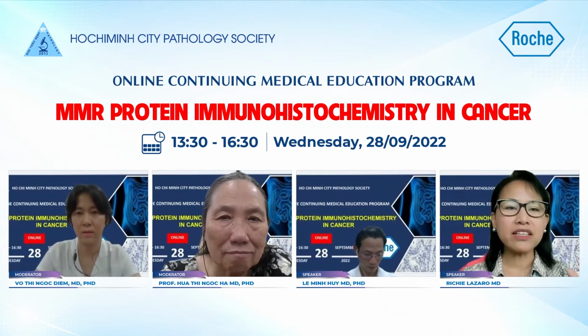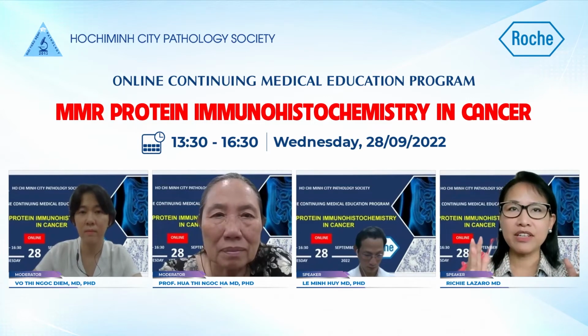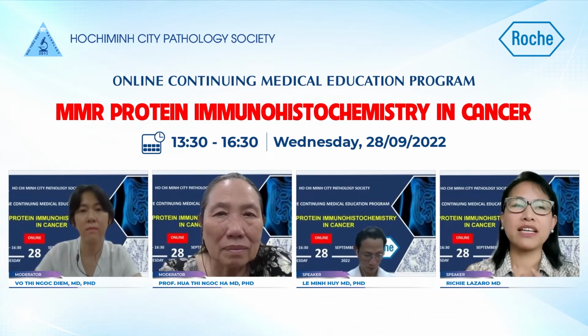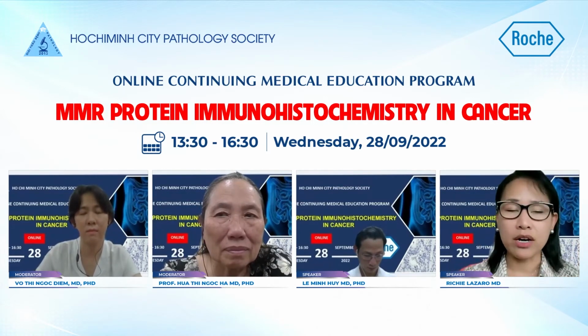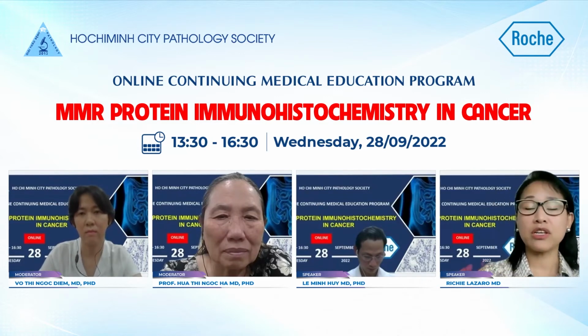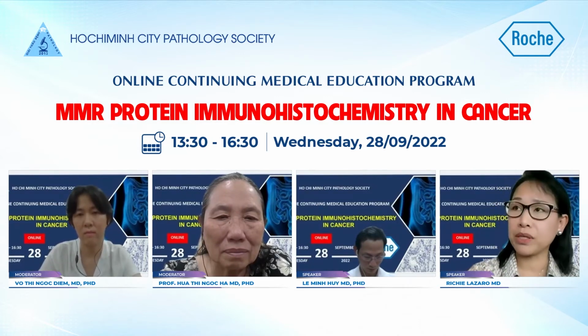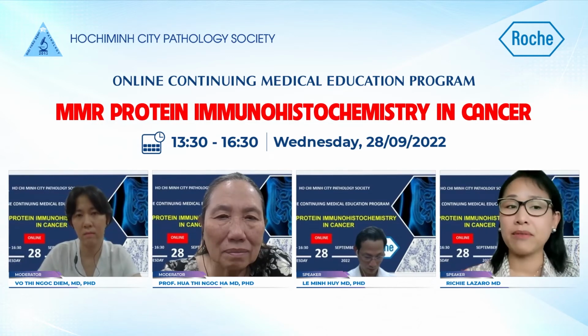To be honest, whatever limited specimen we have, we just have to make the most of it. And in case of MMR, this might really be the judgment call of the pathologist in discussion with the oncologist who might be wanting to do immunotherapy.